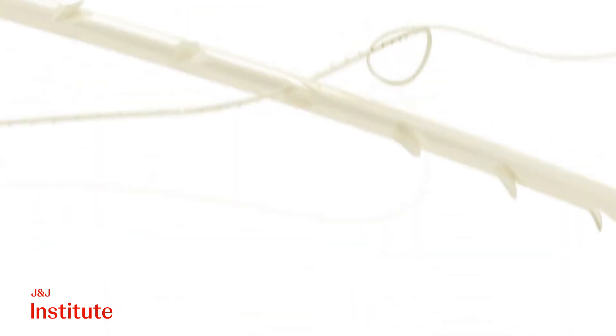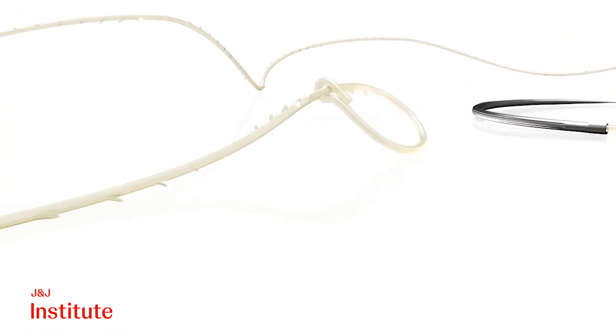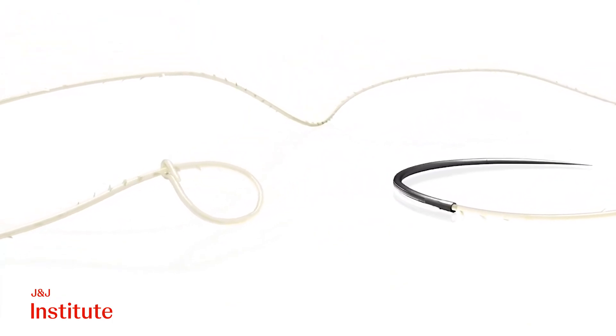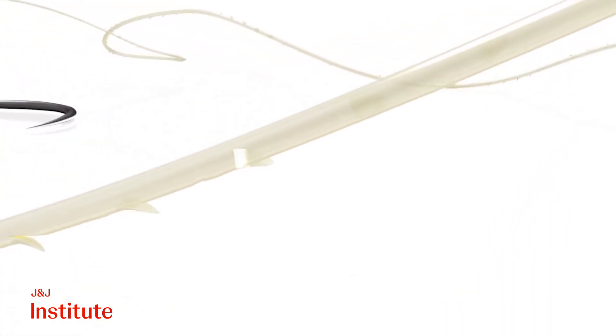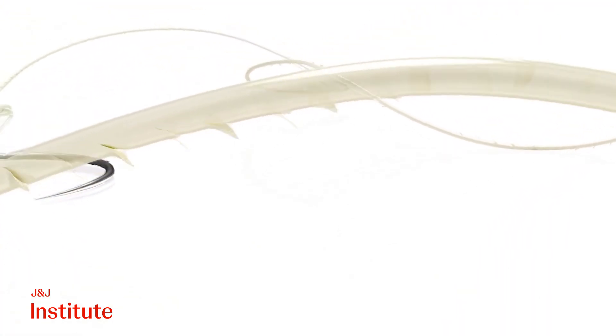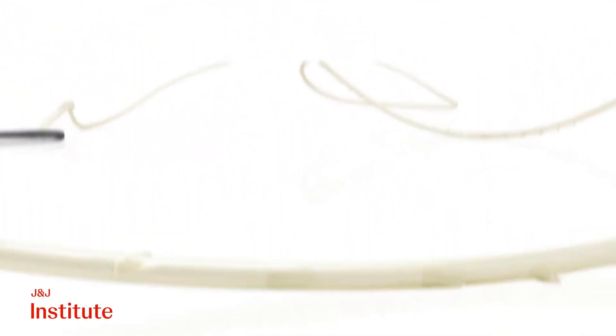In this demonstration, I'll illustrate a subcuticular closure using the Stratofix Spiral 3O suture composed of polyglacaparone 25, an absorbable material commonly known as monocryl plus. Usually, the suture is undyed, but I am using a dyed variant over here for ease of visualization.